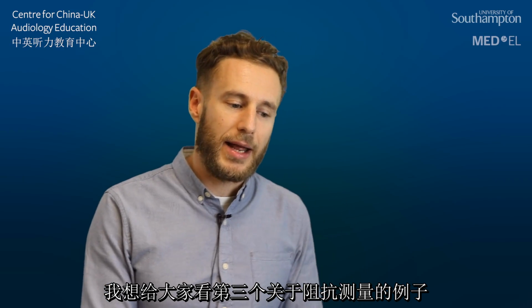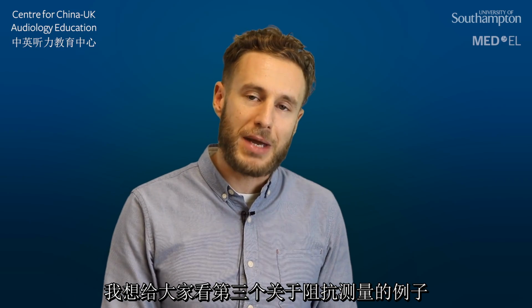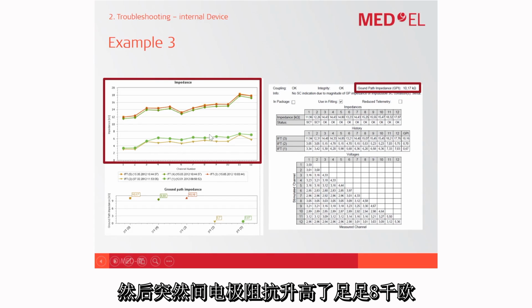Okay, so here I brought you a third example of an impedance measurement. Here again you can see that the measurements in the past returned rather normal impedance values, and all of a sudden you see this dramatic offset here where values are roughly 8 kilo ohms higher than they used to be.